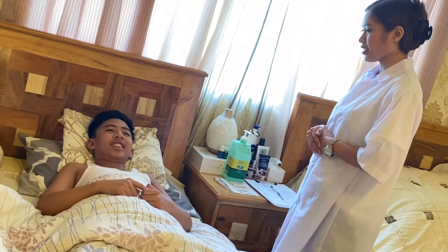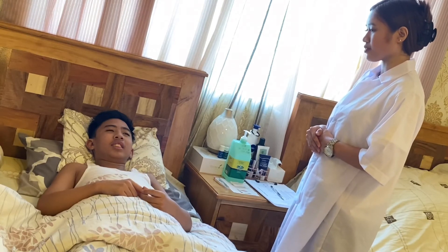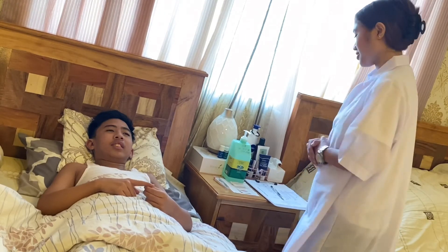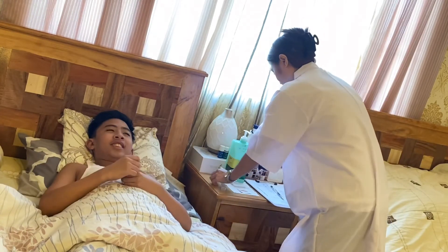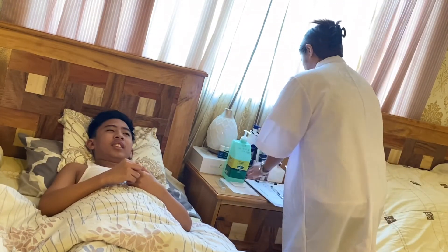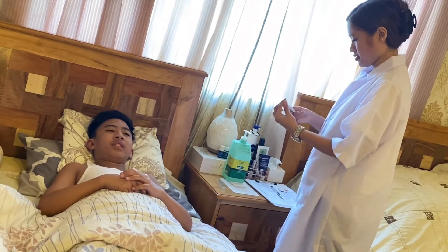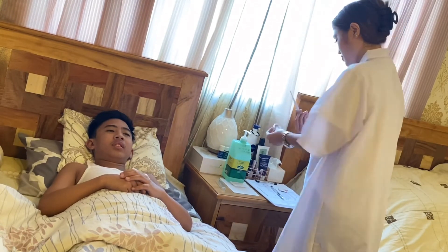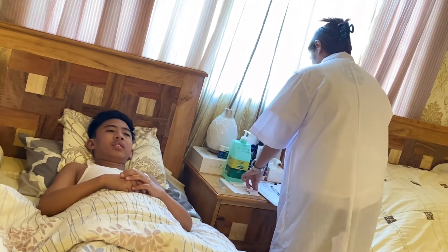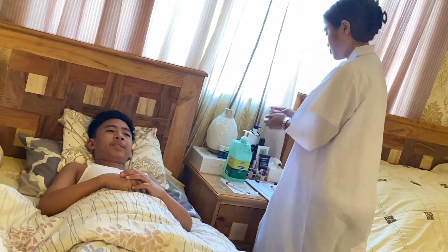Yes. Before I proceed, I will assemble and clean the equipment needed and do hand hygiene. Before using the thermometer, clean it with an alcohol swab and wipe it from the tip to the body. You can now place it in the appropriate site. Then do hand hygiene.